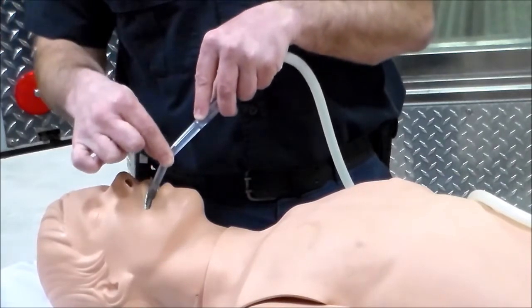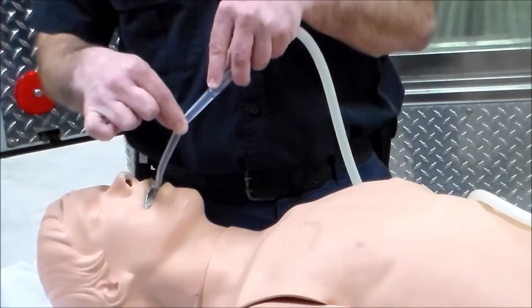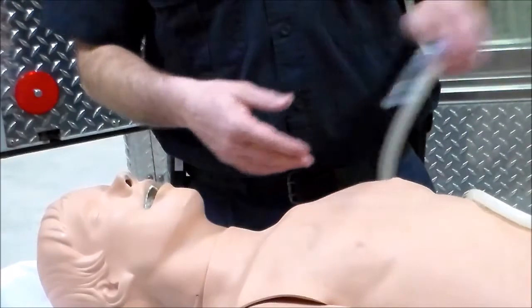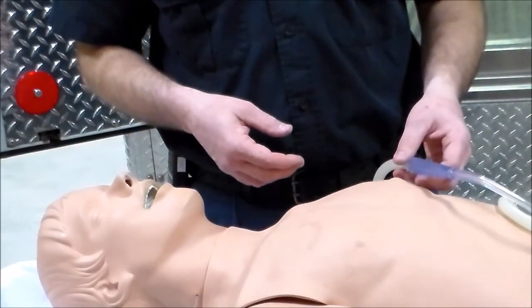I am not going back so far as to cause a gag, and I am suctioning on the way out. I then take the tubing and flush it out so it does not become kinked up. And that's it.